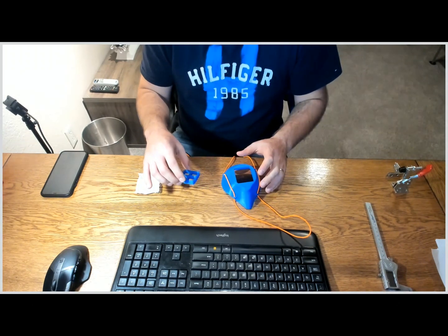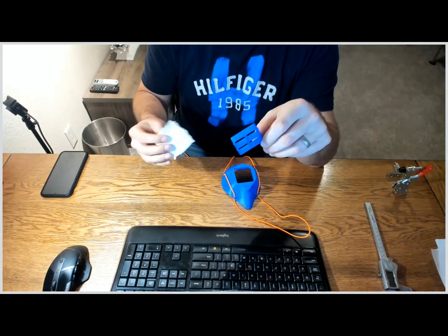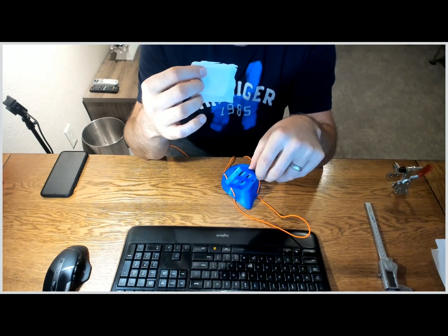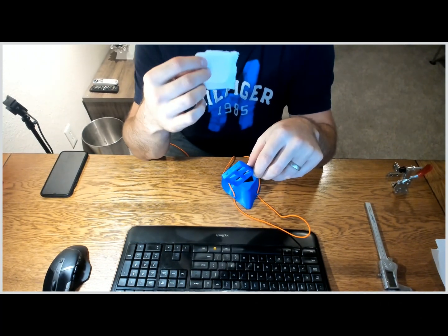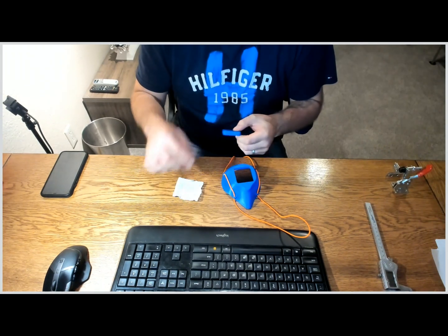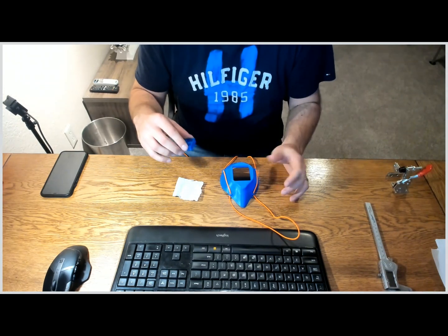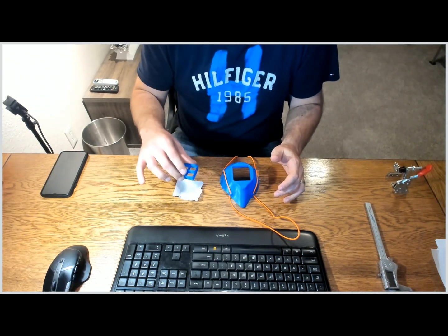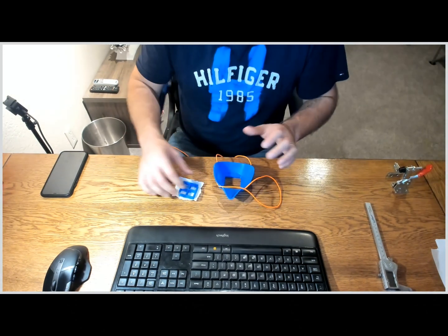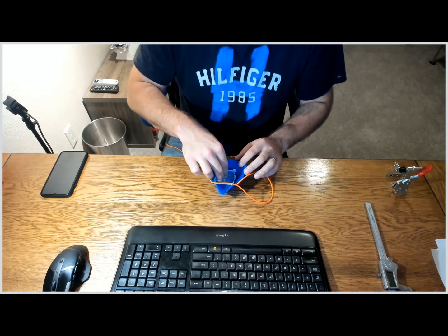The other part included in the file is this part which holds the filter. They instruct you to cut — especially for hospital staff — a 2.5 inch by 2.5 inch piece of N95 mask material. The concept is you can cut one N95 mask into, I believe, six pieces and get six reusable masks out of one N95 mask. You take the filter bracket, it goes in there like this — just put the mask face down and put it in there. It makes a pretty tight seal.